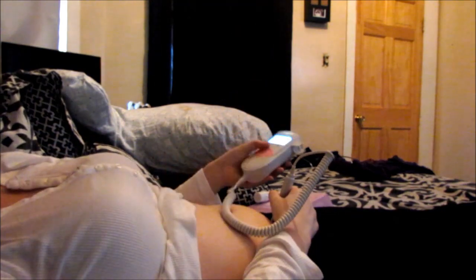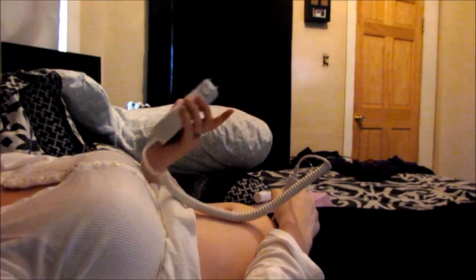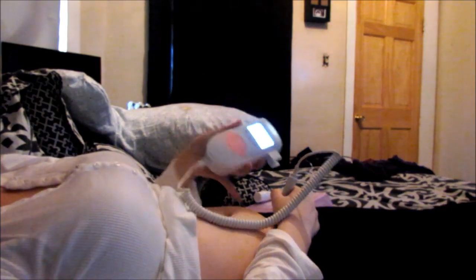There's also arteries that are in your stomach, and you might think that's the baby, but it's not actually the baby. And I'm going to show you what those sound like.